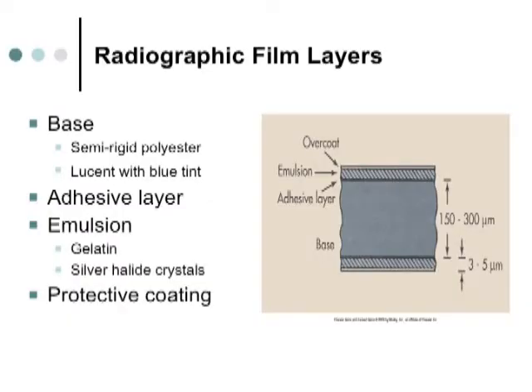And this is what I was trained on, with film, and I have had to learn digital since then. But with film, we use regular radiographic film, which has a base to it, which is made out of polyester, and then painted onto that base is a silver bromide emulsion that is light sensitive. Okay.